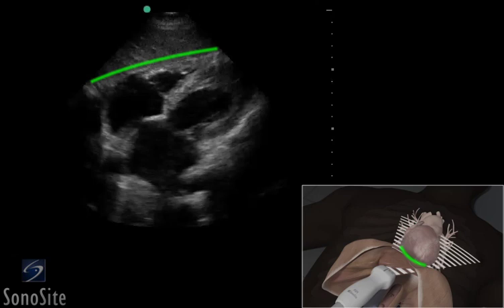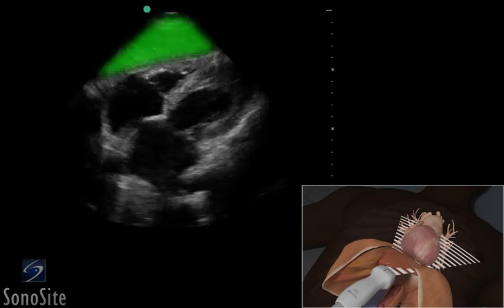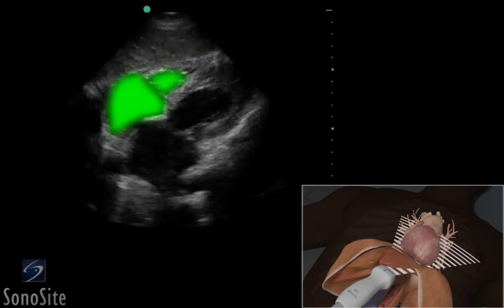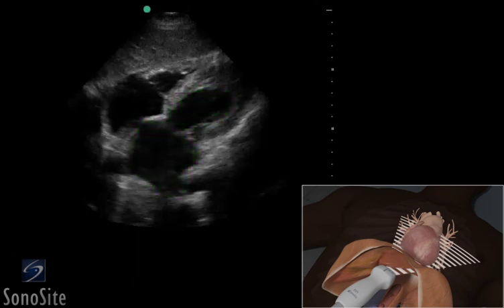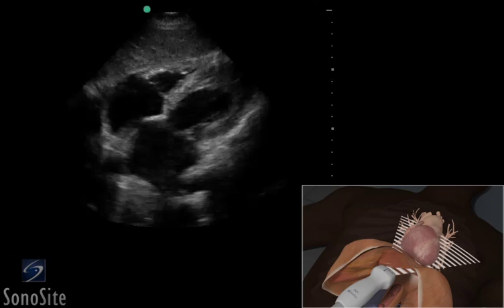Increase scanning depth to visualize all chambers of the heart. The first structure seen closest to the transducer is the liver. The right side of the heart will appear closer to the transducer than the left side of the heart on the ultrasound image. The myocardium will appear gray, and the blood-filled chambers will appear hypoechoic. The bright white pericardium is seen surrounding the heart adjacent to the gray myocardium.